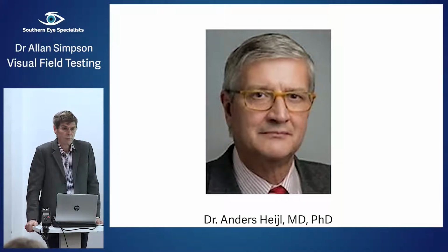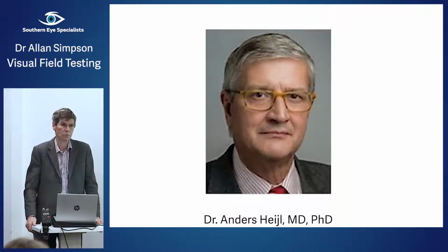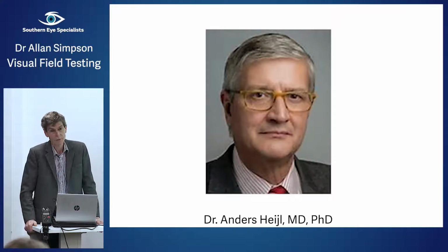I'm just going to take you through my first 3 months' experience of that new algorithm. And it was particularly poignant, I suppose, because immediately we started using it, I saw 1 or 2 tests coming back that didn't quite marry up with the ones I'd seen before in terms of series. And I thought, this is a wee bit different. I wonder what that means. And particularly 1 or 2 that seemed to be missing early glaucoma defects with the new machine and new testing algorithm compared to the previous one.